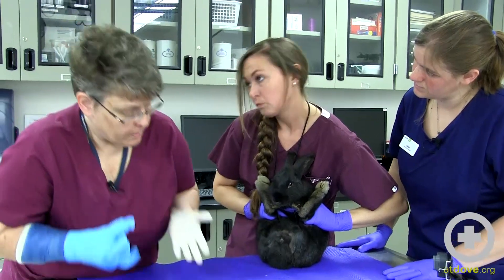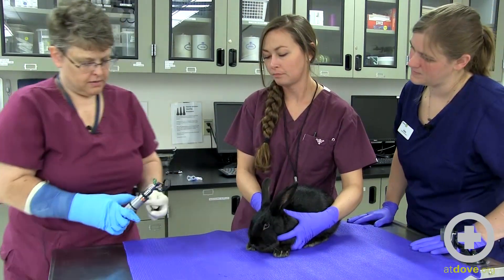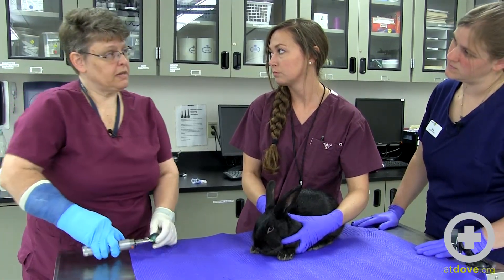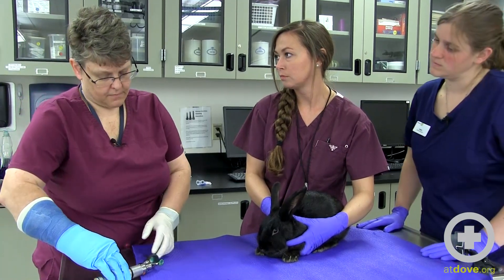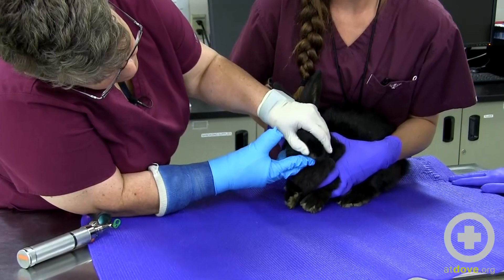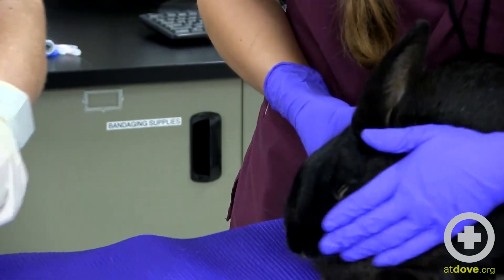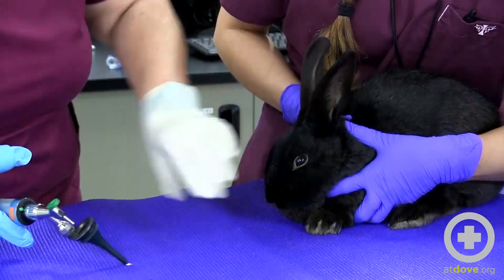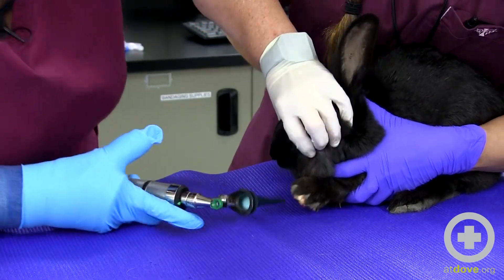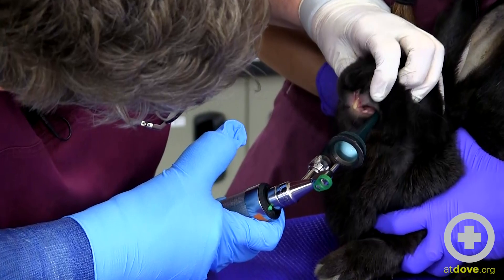What's important is to kind of roll them back into a normal position — it seems pretty stress-free for them. Mucous membranes are another thing we want to evaluate, and rabbits can be a little challenging with that. We're also going to get a quick look doing an oral exam. Rabbits don't want their mouths messed with, but you might be able to get a quick peek to see he has good color. Very often, one quick thing to do is to use your otoscope — cradling his head, rabbits do calm down when you cover their eyes. Put that right in his cheek there and spread his lip back a little bit to get a peek in.